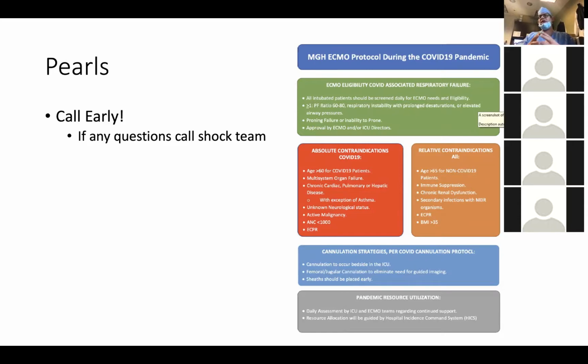We also have pretty limited data now on how these people do with ECMO, unlike H1N1. So it remains to be seen. This is a moving target. We may find out from Iran, China, and Washington, who are a little ahead of us, what their best practices have been, who's a good ECMO candidate, any other predictors of disease progression that may let us know this person is or isn't a good ECMO candidate. That's the talk for now.